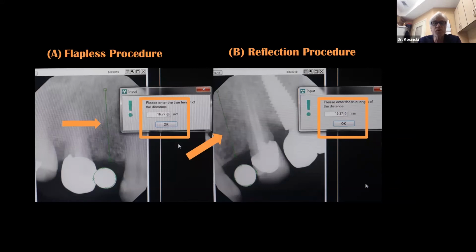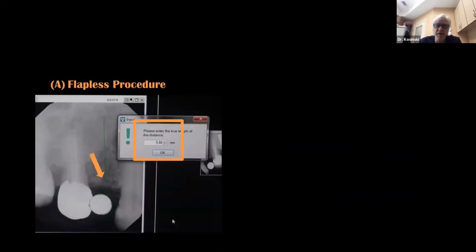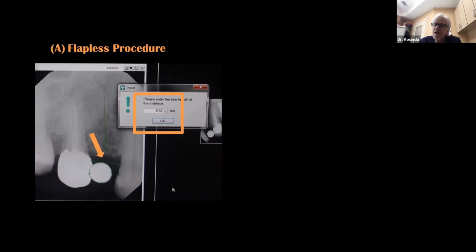So using our digital radiographs, we have available height of bone, but do we have available width of bone? And that's the question that we have to have. So again, using that same ruler, we can actually measure the distance mesial distally we have in that edentulous space. And we have nearly 6 millimeters. Now, the rules of thumb with our dental implants are very precise and very accurate. We should not be any closer than 2 millimeters from an adjacent PDL. That's in the literature, it's very physiologic.